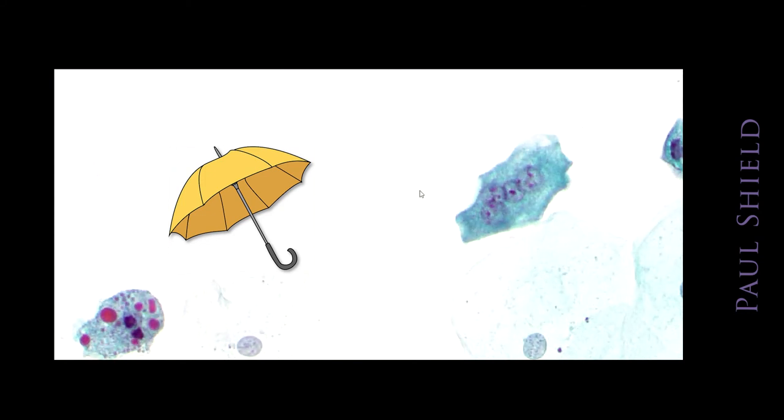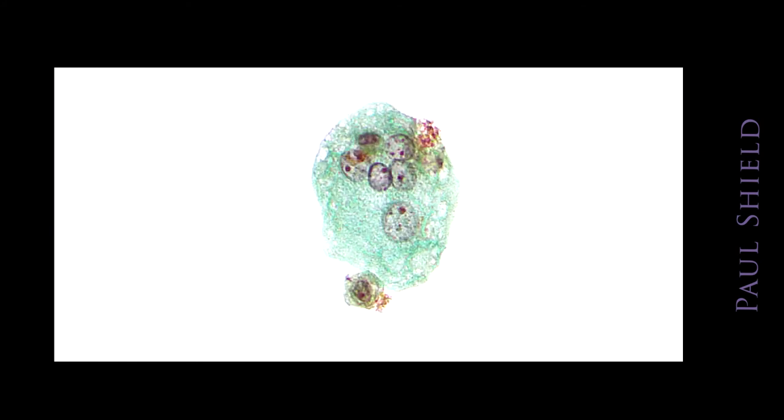This is an umbrella cell. It's one from the superficial layer, outermost layer of the urothelium. It's multinucleate, fairly prominent nucleoli. That's not unusual. See this cell down the bottom left hand corner? This is a degenerating urothelial cell, and often they have these eosinophilic bodies in them. It's just a degenerative change. So bi and multinucleation are both fairly common in urothelial cells.